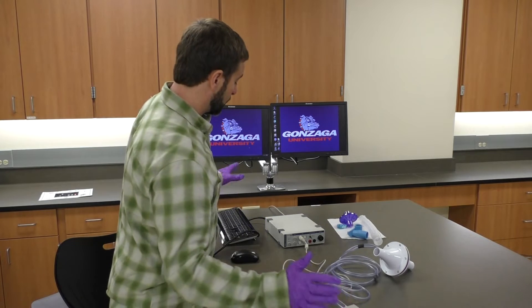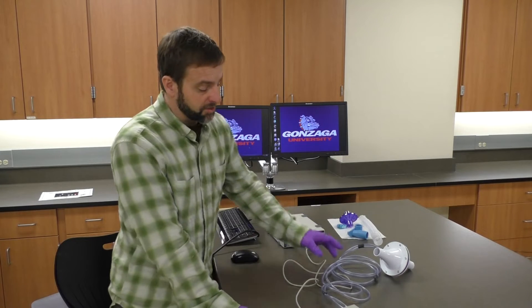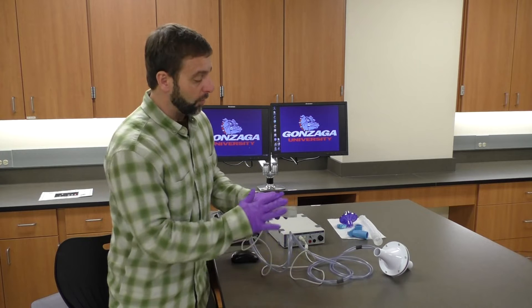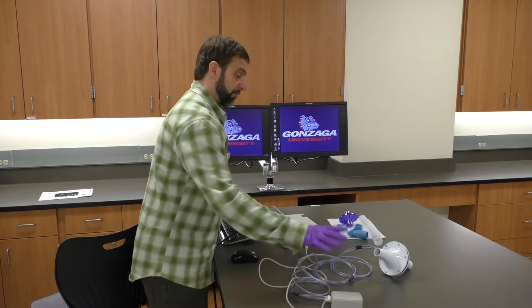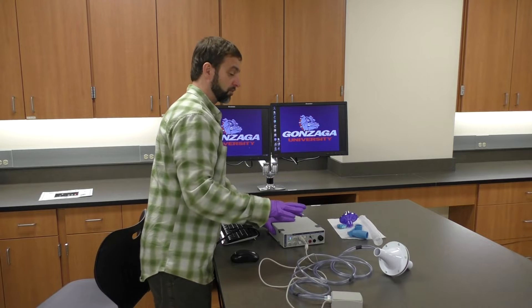Once that's set up, I'm going to start this up. This spirometry pod will need to warm up for 5 to 10 minutes. We already warmed it up, so there's no need to wait again. We are basically ready to set up the connection that will go out to our subject.